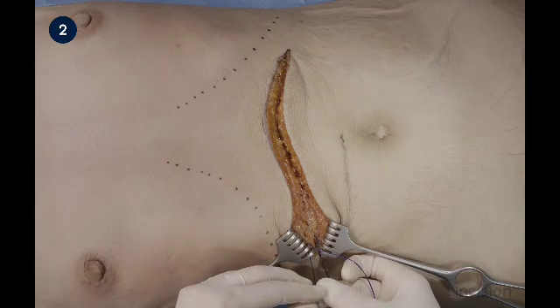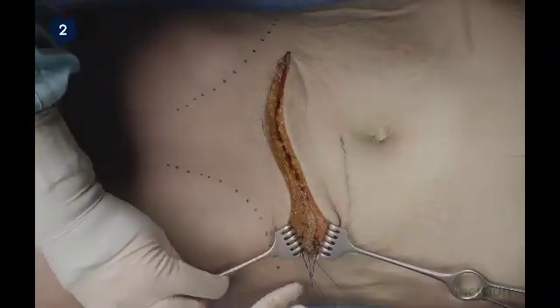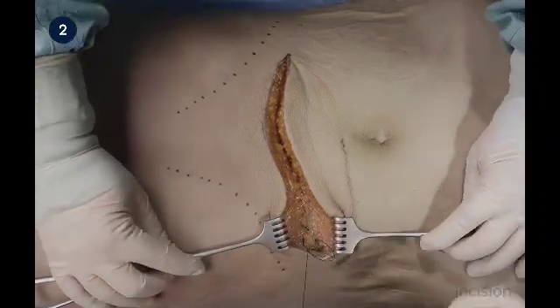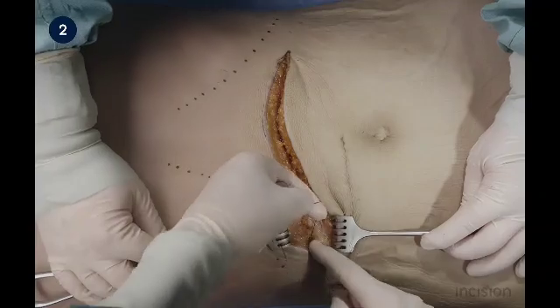It isn't necessary to close the subcutaneous fat in the midline. The closure of the skin is not shown in this film. The skin is closed, preferably with a running subcuticular absorbable monofilament suture.